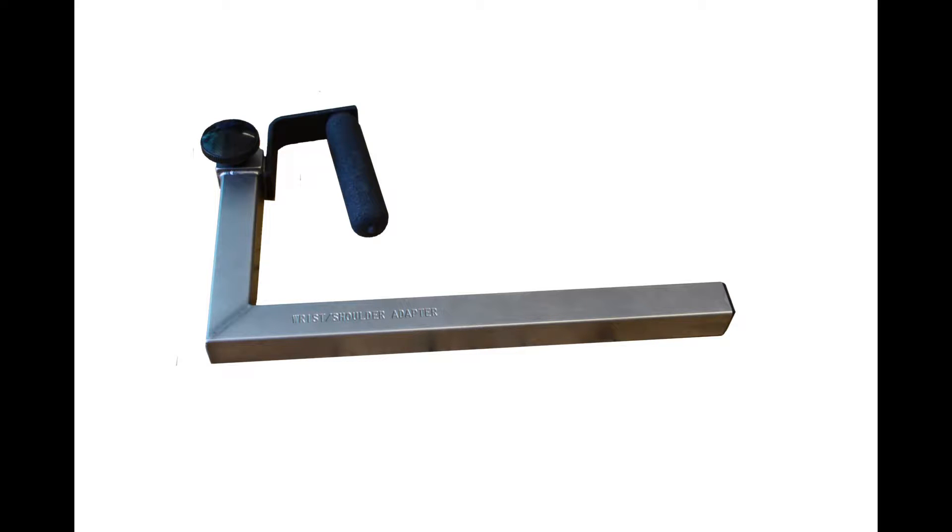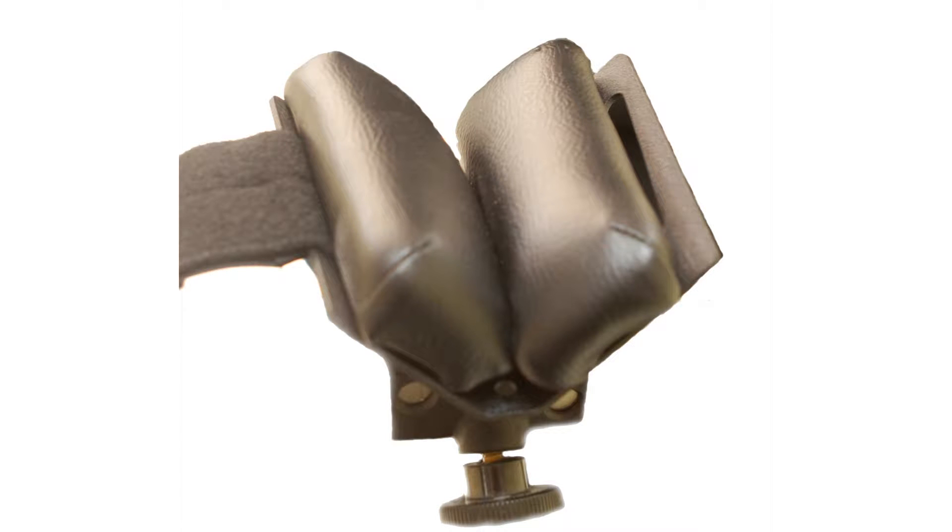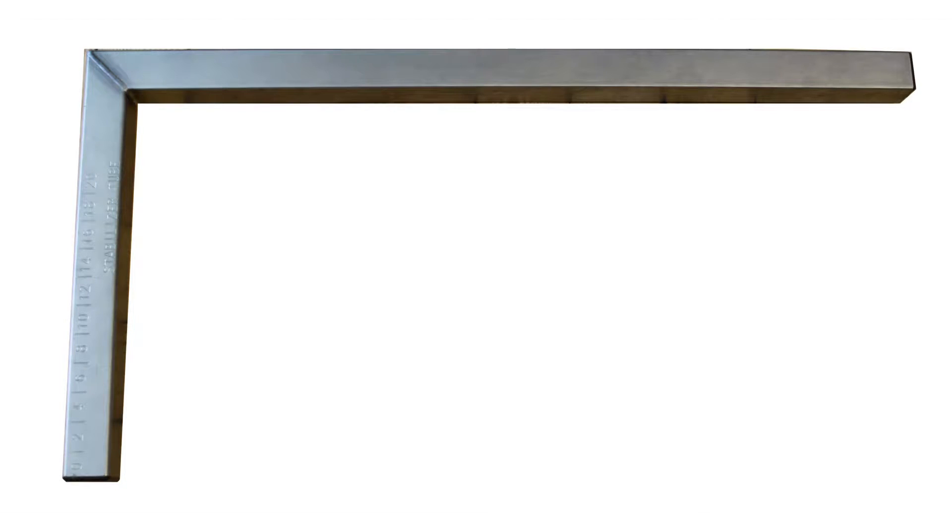We will need the wrist shoulder adapter, the forearm stabilizer V-pad, the thigh forearm stabilizer tube, and the lumbar cushion may be required for comfort.